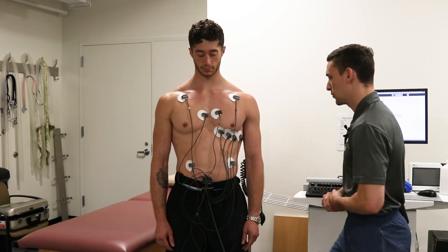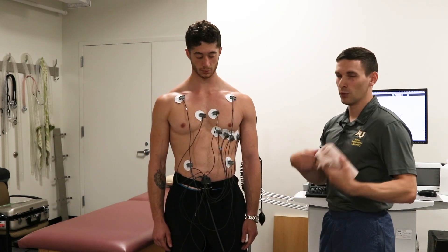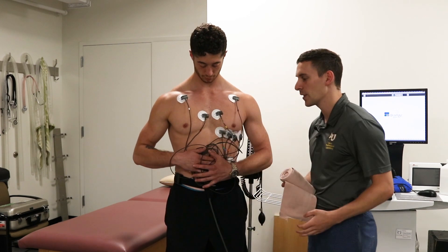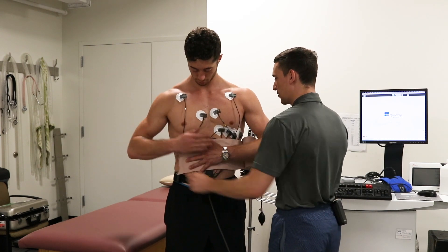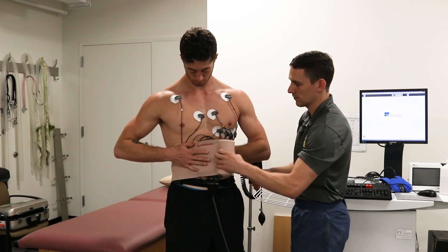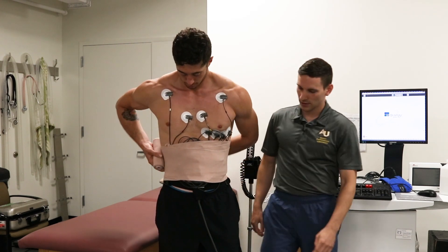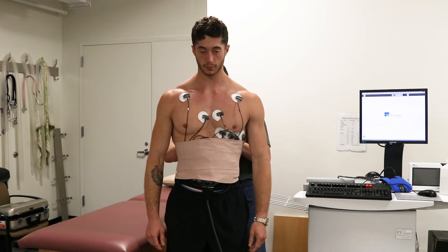From here we find a bandage roll — we also have small tight vests to ensure wires aren't moving too much. We ask the subject to bunch the wires on their stomach, grab the bandage, place it down, have them hold it and begin wrapping around. We can just tuck the end in the back.